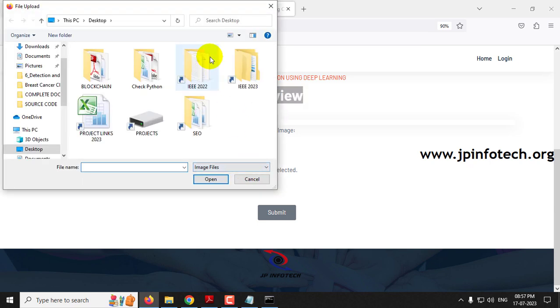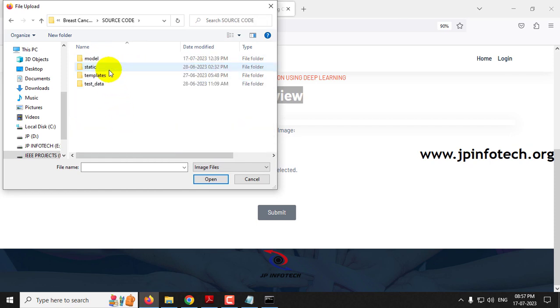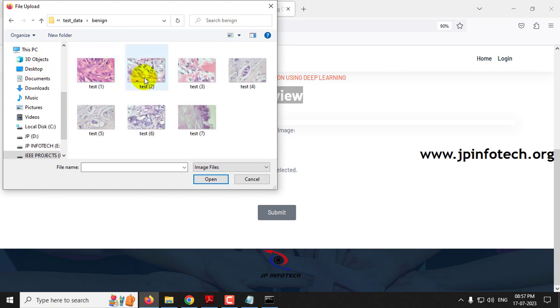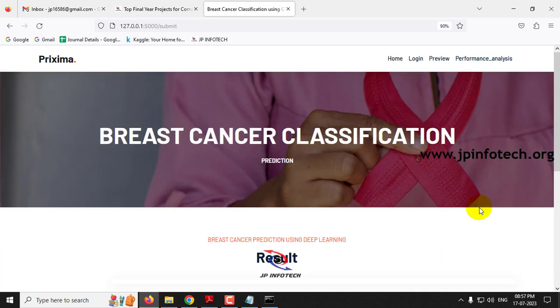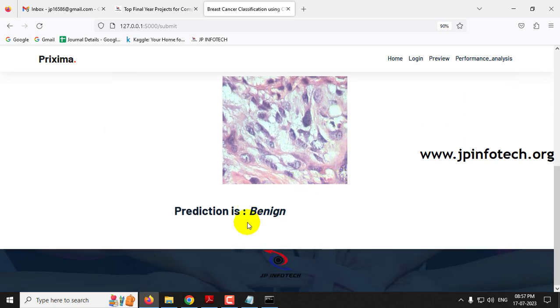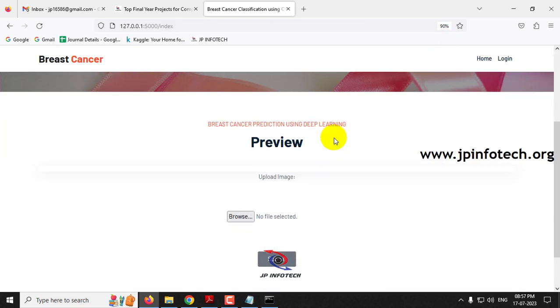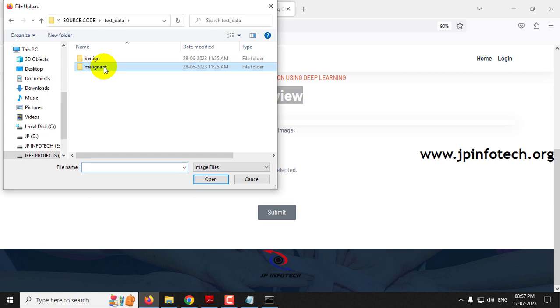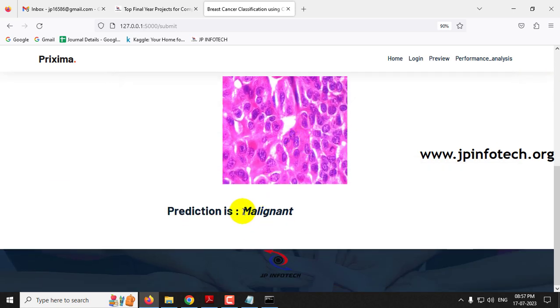Click the browse button and navigate to the project source code location. In the source code folder you will find the test data with two cases: benign and malignant. Select a benign image, preview it, and click submit. The predicted result shows 'benign.' Then navigate back to the preview page, select a malignant image, and click submit. The predicted result shows 'malignant.'